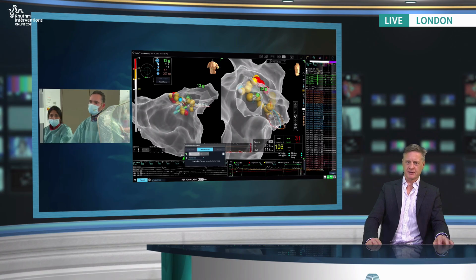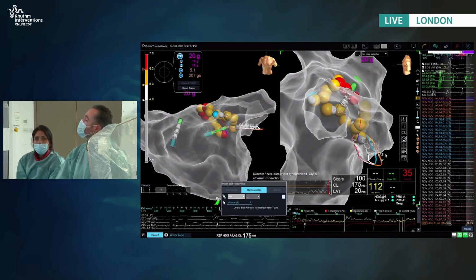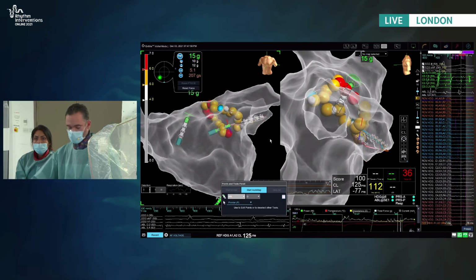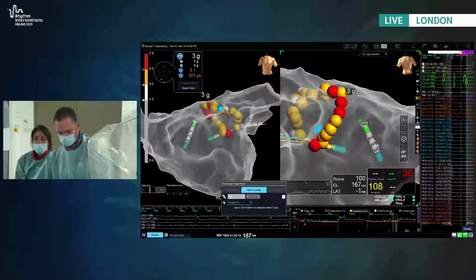So Ross, you're being very disciplined because there's 3 of the 4 founders of star mapping on the broadcast. I can see Sherry in the background there, who was the young investigator winner a few years ago at HRS. Yeah. Shall I go? So PA on the right?